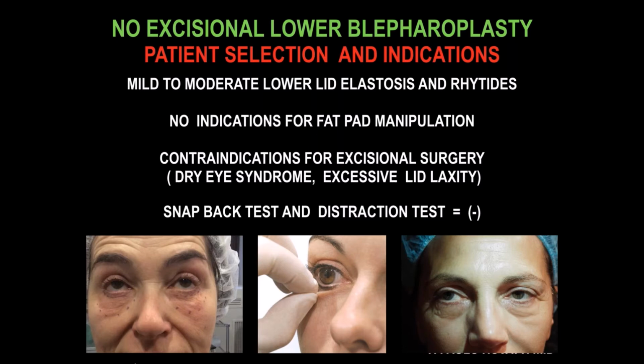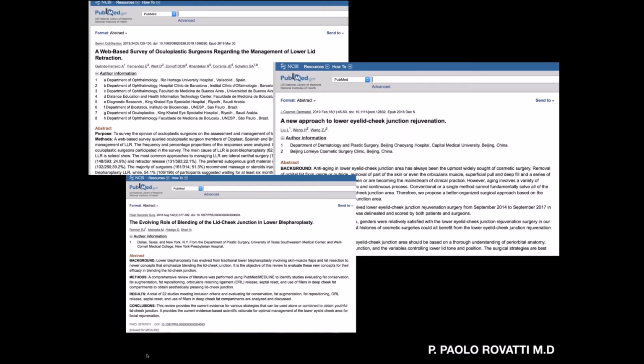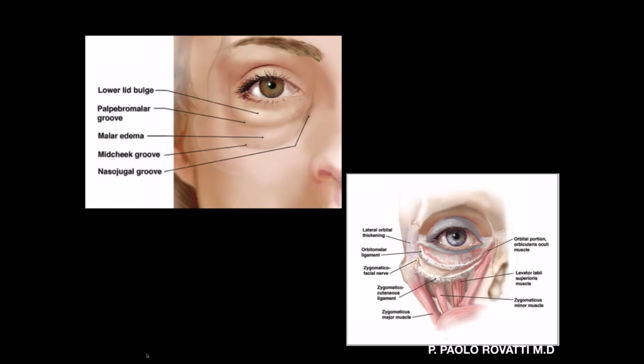If it's negative, it's okay, you can do it, because if not, I can show you afterwards some of my mistakes, treatments that were too much, where the tests were positive. There are many plastic surgeons, oculoplastic surgeons speaking about the management of lower lids, but now we must also speak about this treatment that is treating all the lower lid bulging, and please respect the orbital malar ligament. So please don't go above the orbital rim, and so you are safe and you don't have the problem of scleral show or ectropion sometimes. And so you can stay just above the zygomatic ligament and below the orbitomalar ligament.